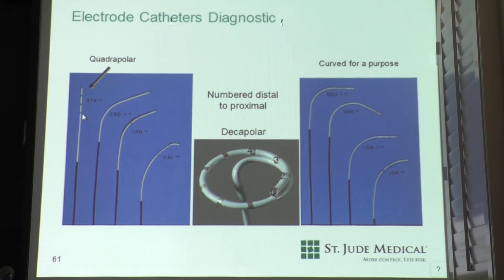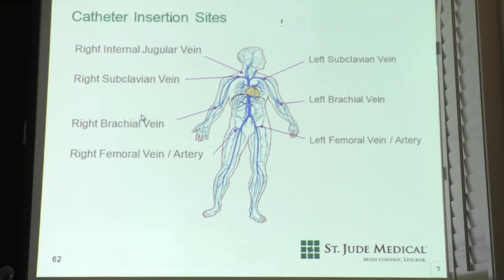different locations physiologically. So what do you think the CS catheter goes into? Coronary sinus. You got it. Cournands and Josephsons are often designed for either the right atrium, the HIS, right? That's our term for the AV node signal. The compact AV node is called the HIS. It's a little spike in between the A and the V. So I said A, V, and HIS, right? These are only going to go where they're shaped to go. So sometimes it requires a little maneuvering, since you can't steer it very well.